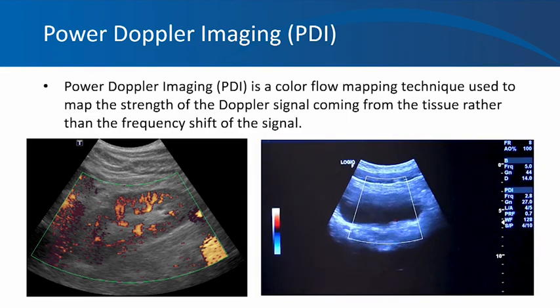Depending on the intensity of the echoes, it is brighter and lighter at places instead of the color coding that we have, such as blue and red. It's usually of the same color, but darker and lighter. So it is more sensitive for vessels with low blood speeds. We don't use it routinely in kidney ultrasound, but you may use it to detect ureteral jets when you are imaging the bladder, like it is shown here. So ureteral jets are the intravesical urine ejaculation owing to the pumping effects of ureteral peristalsis. Their use to rule out or rule in obstructive uropathy is controversial, but they definitely look pretty and are fun to watch.